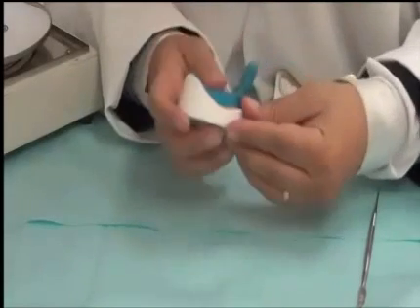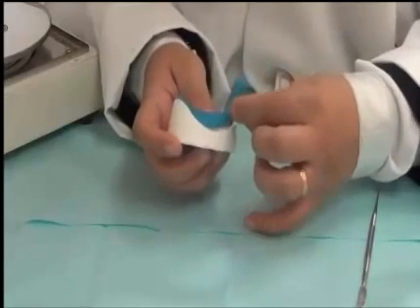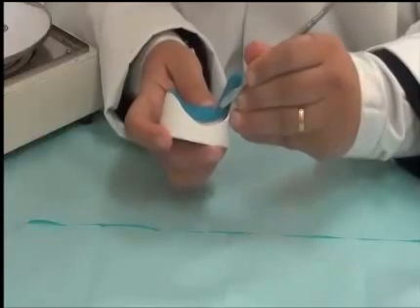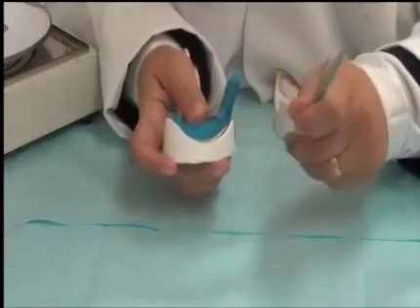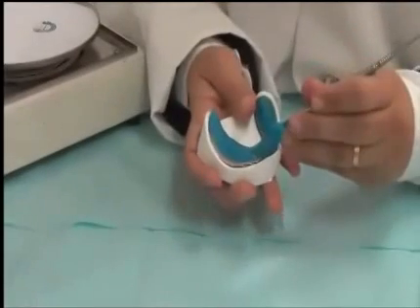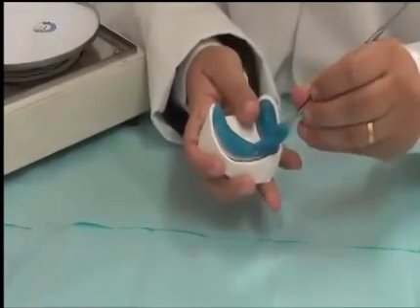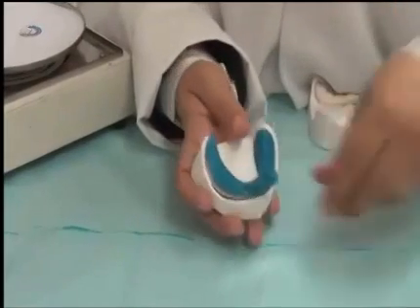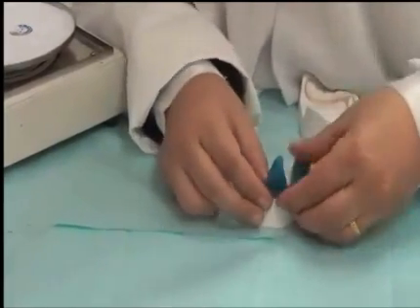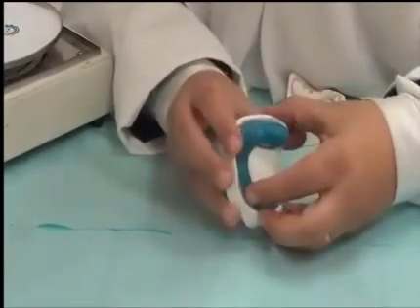And to make sure that it's adapted well, when we have done the first layer, we don't place Vaseline in this area to make sure that the handle adapts to it. And wherever a hole is covered, we re-expose it to make sure it's still present in the handle as well. So, the handle is in. We thinned it. We have removed the bulk from here. We have removed the bulk from here.